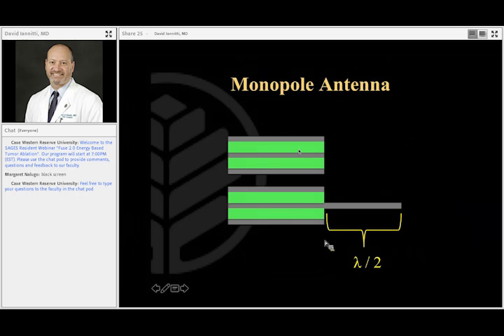So when you're going to slice your coax to your TV, you cut off the outer conductor and the PTFE, and you leave an exposed inner conductor, and then you have a connector here and here. Well, to efficiently transmit microwaves or radio frequency energy, that length of exposed inner conductor needs to be at least half the wavelength. So shorter than that, you need to push more power, but you need half a wavelength there.